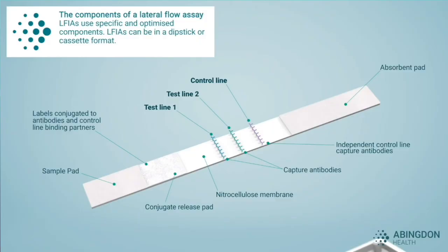The second technology to measure the troponin levels, as indicated by the previous table, is by using lateral flow immunoassay. It is a paper-based microfluidic system composed of a sample pad, conjugate release pad, nitrocellulose membrane, as well as an absorbent pad.